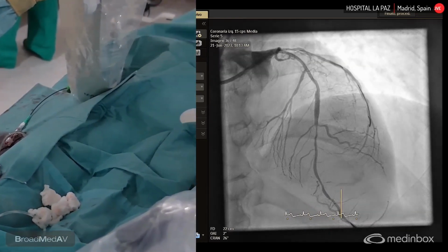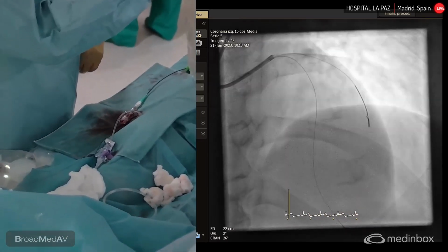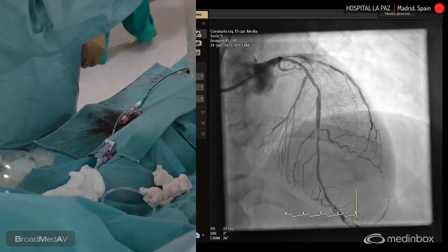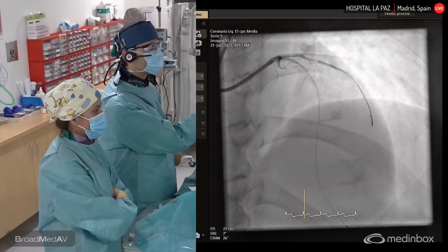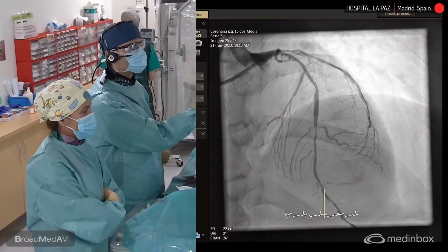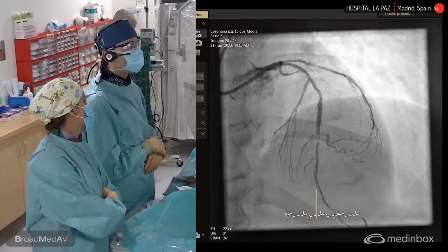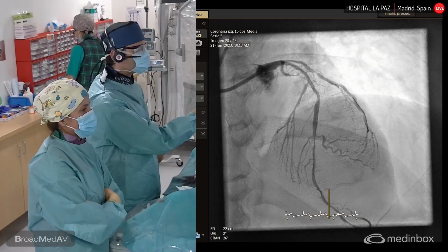This patient has been included in the Multivessel TALENT trial that Borja explained, comparing the Synergy against the Supraflex Cruz, this ultra-thin stent that we are using more and more in our country. All the patients should be treated with dual antiplatelet treatment with novel drugs, prasugrel and aspirin, and all the implantation should be optimized with imaging.